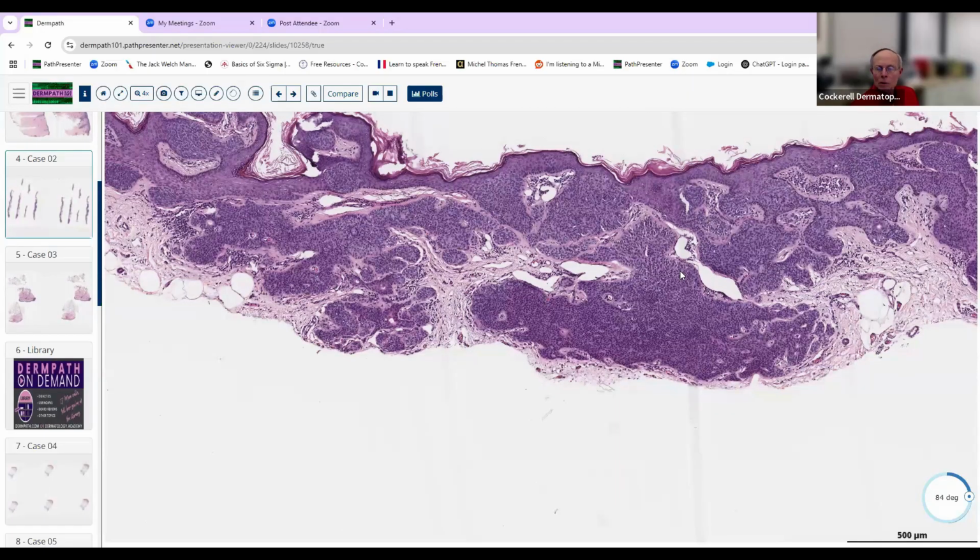And that's a very interesting little stem cell area, because that little zone can lead to a lot of different structures. It gives rise to the sebaceous duct and the sebaceous gland. It gives rise to apocrine epithelium. So that all comes right off of that little area. And it's also the site where the stem cells live when the follicles cycle, and it reforms the new inferior portion of the follicle once it goes into telogen, into the resting stage. So given that, it can also form these primitive follicular lesions.